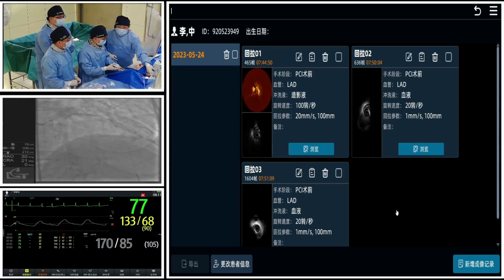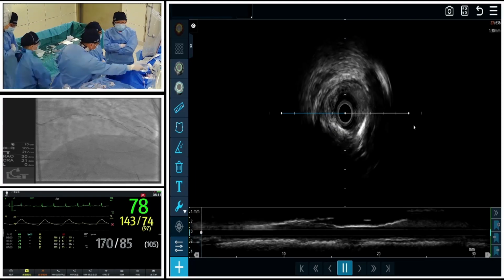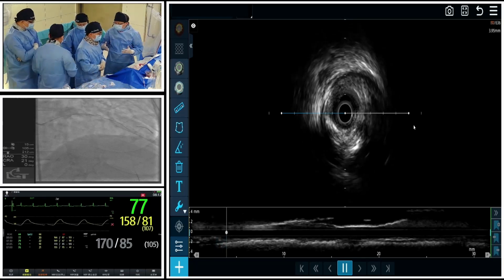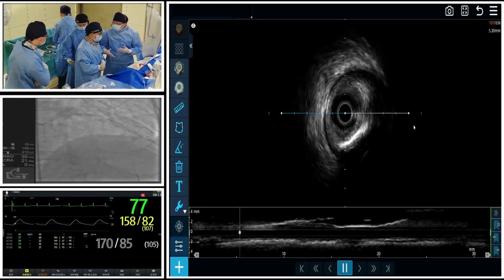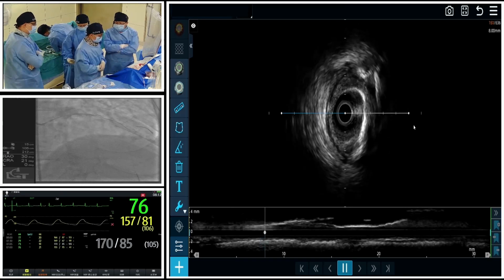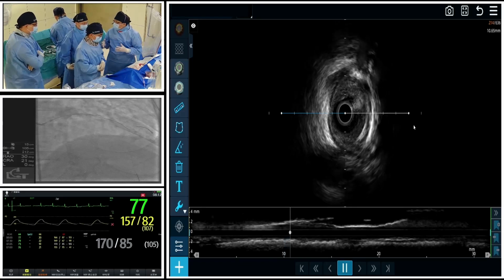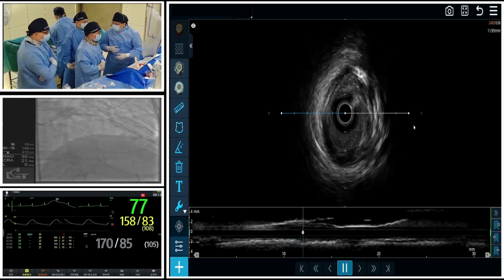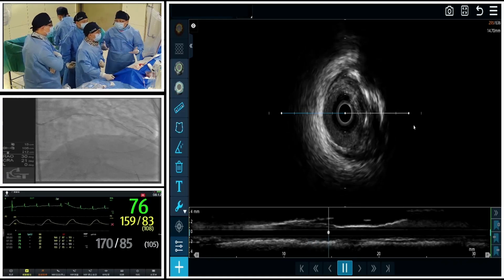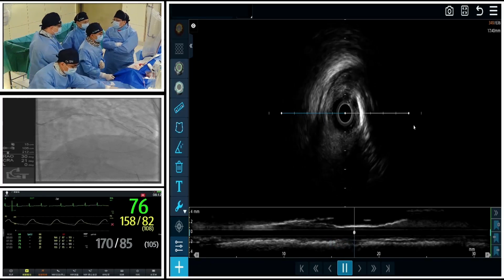Okay, Dr. Chao already introduced the panoramic vision system. This is also a domestic system, integrating both advantages of IVUS and OCT. Dr. Chao already introduced the result of the intravascular imaging, and the result is similar to the 3D reconstruction just now. The system we already showed in the 360 live stream several times.